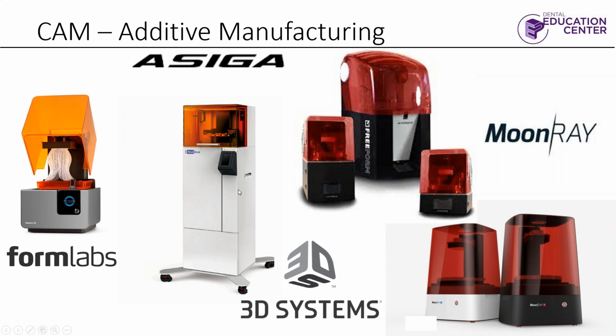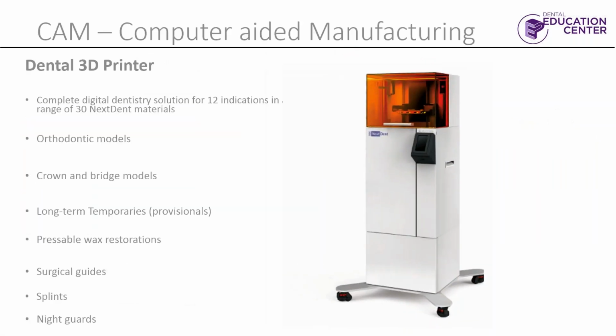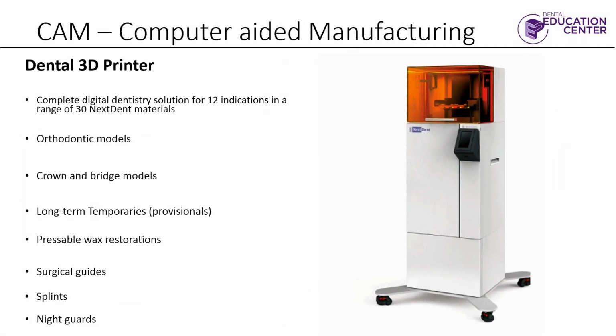I haven't had it for very long, in all honesty, so my experience is somewhat limited. Sure. It is a good example of the benefits and drawbacks of an open versus closed system, because I'm going through that process of figuring out which materials I like in it and which ones I don't think work all that well in it.